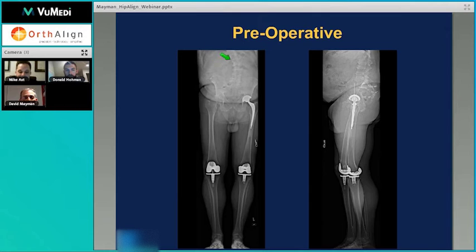you can see that this patient has a pretty significant scoliosis. Number two, you can see that this acetabular component, even from here, looks pretty flat. And number three, when you look at the lateral x-ray, and I recognize that people don't often look at these lateral x-rays, so they're a little funny to look at, but it really looks very flat. So you can imagine if this person went to a sitting position, how easy it would be to impinge in the front here and dislocate out the back.